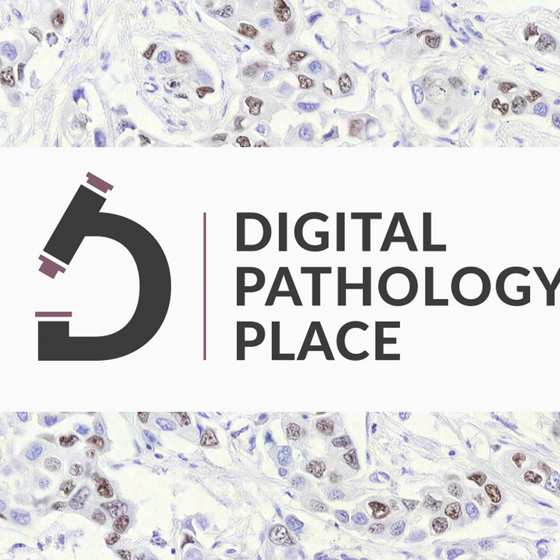Immunohistochemistry is essential for diagnostic, prognostic, and predictive biomarker assessment in oncology. Manual interpretation, we've heard that in 3 or 4 of these abstracts already, is limited by subjectivity and inter-observer variability. But we have our tools that can help, machine learning and AI, and this allows algorithms to recognize patterns and learn from annotated data sets, or basically paired data sets. Now we have different ways of giving AI the ground truth. We have different modalities.